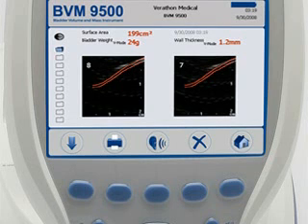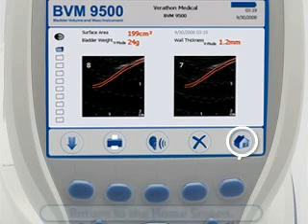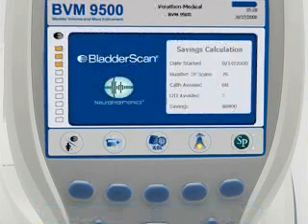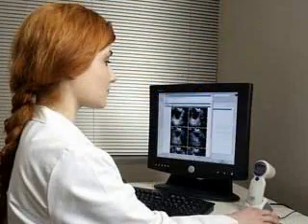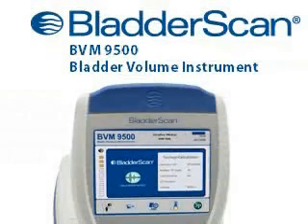If the bladder volume was not between 150 and 400 milliliters, UEBW will be blank. After reviewing exam records, you can return to the home screen and perform another exam. Once you have finished your exam, wipe the ultrasound gel from the probe and turn off the instrument. For users with ScanPoint imaging software, you may log on to ScanPoint to automatically transfer and save your annotated exams to your Windows computer. It's that simple.